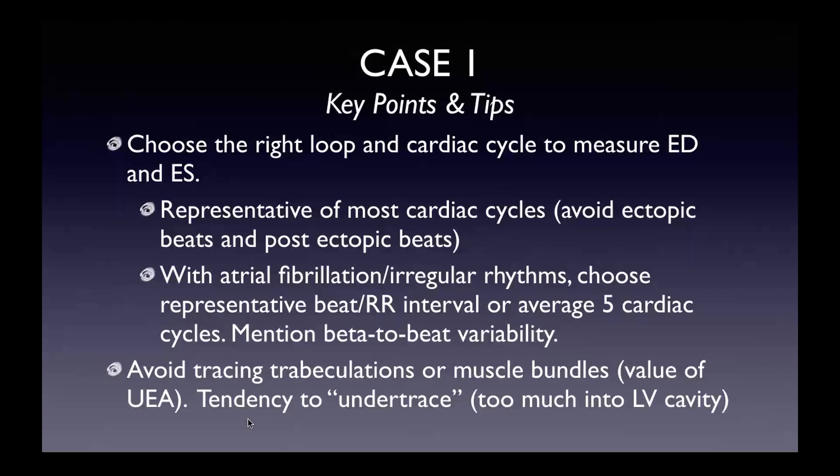With atrial fibrillation or irregular rhythms, choose a representative beat where the RR interval isn't too fast or too slow, or do the painstaking method of averaging five cardiac cycles. If you do measure, mention beat-to-beat variability, especially if the atrial fibrillation is very irregular. Even in sinus rhythm there's a little bit of beat-to-beat variability in contractility. As mentioned, avoid trabeculations or muscle bundles — that's really one of the values of ultrasound enhancing agents. We tend to under-trace too much into the LV cavity, but also avoid over-tracing around that bright endocardium.